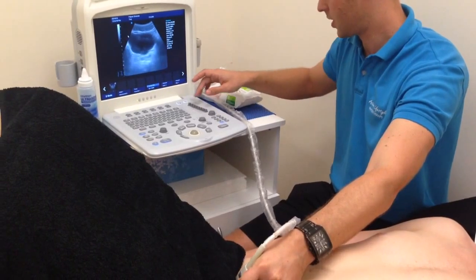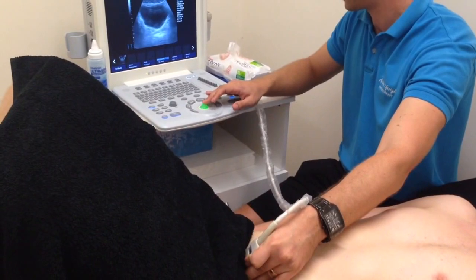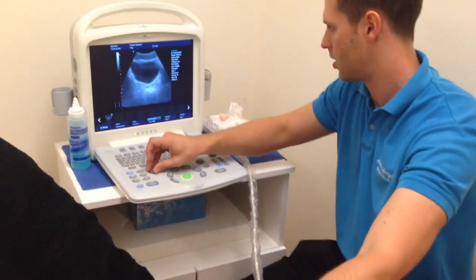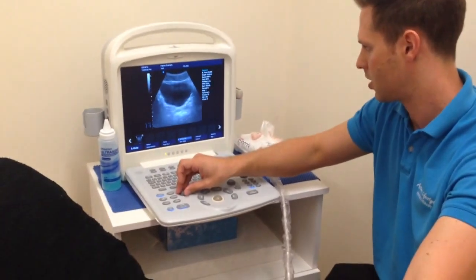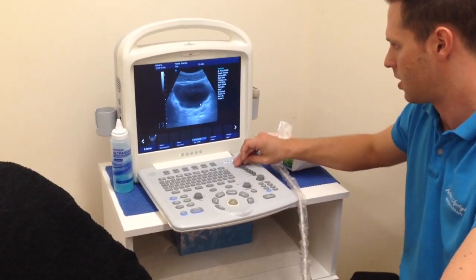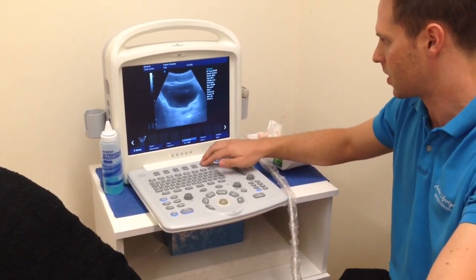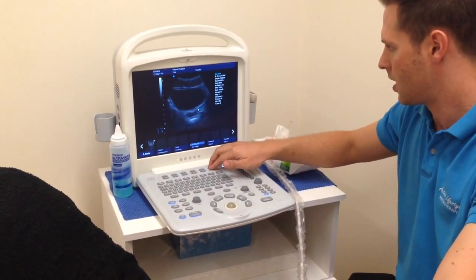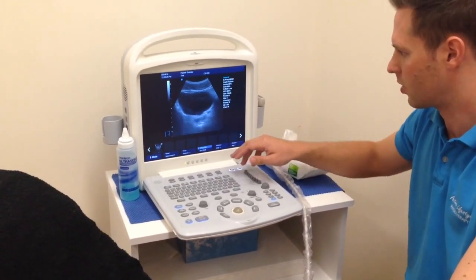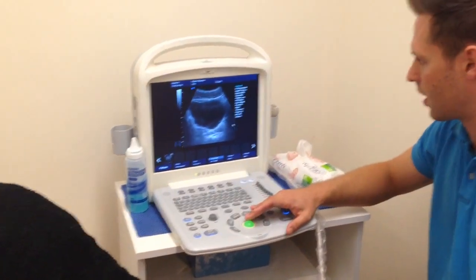We'll just adjust our angle and depth a little bit to give us the best quality image we can. We'll also have a quick look at the frequency — changing it to 6.5 here gives us a very crisp image and we're not losing too much power at the bottom of the screen, so that should be fine.